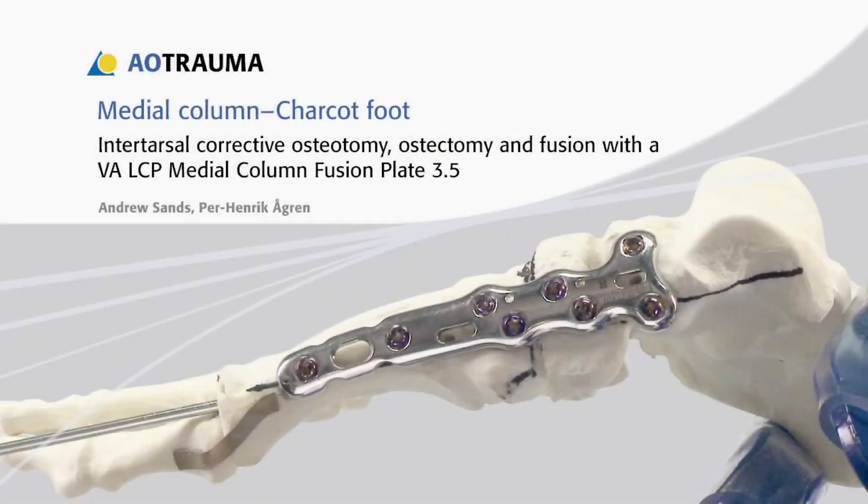In this presentation, an intertarsal corrective osteotomy will be made to correct a Charcot deformity of the medial column. The fusion will be secured with a VA-LCP medial column fusion plate 3.5. It should be understood that the goal of the procedure is to provide functional reconstruction of the medial column rather than restoring the normal anatomy.